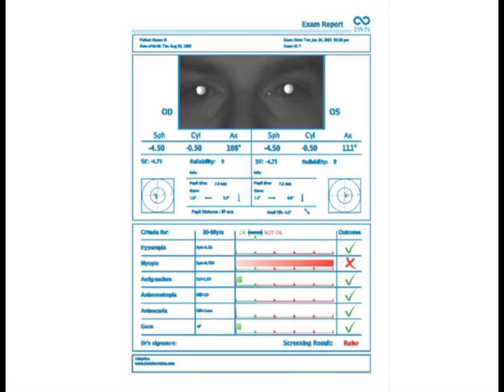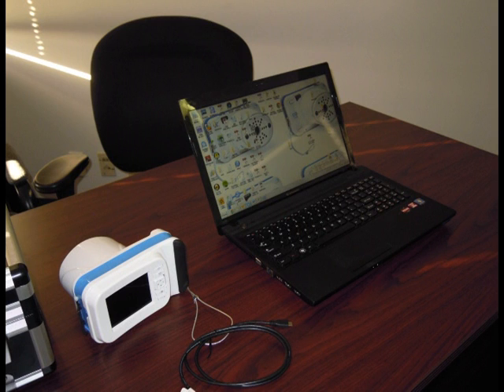When using the 2-WIN for screening purposes, you can download a targeted report explaining the out-of-range parameters and the need for a more complete eye exam from the 2-WIN to the computer. You can then print it on any printer and hand it to the patient.